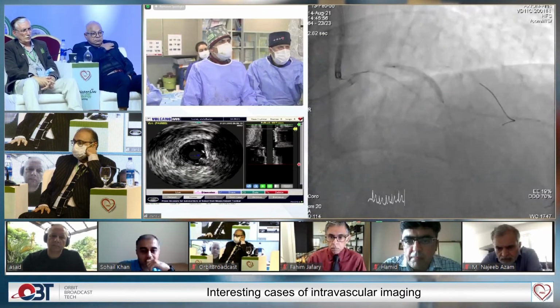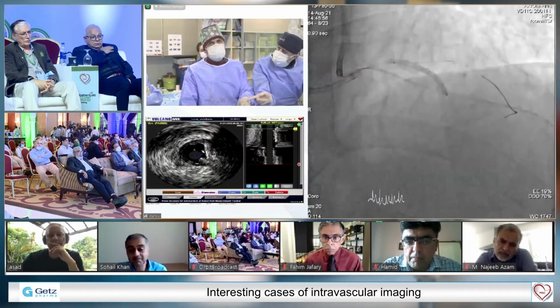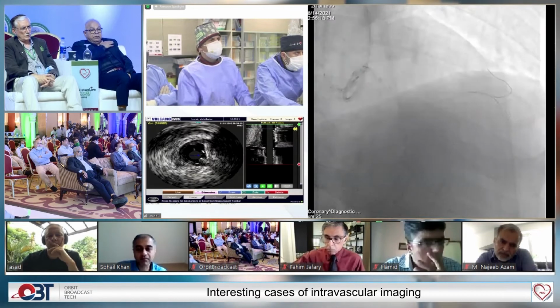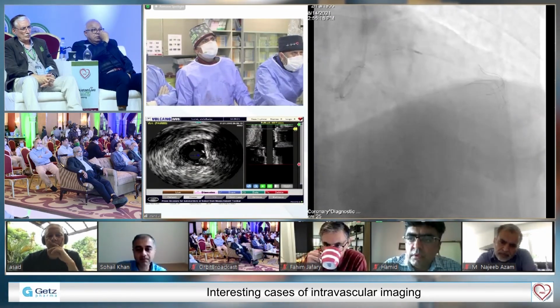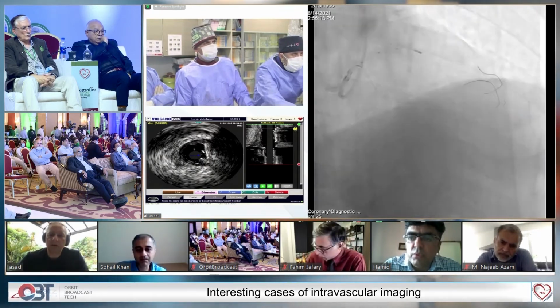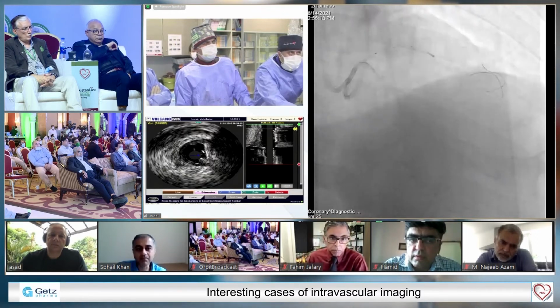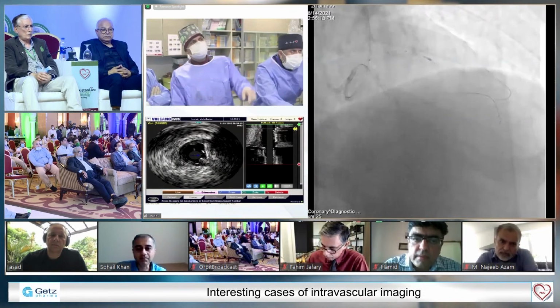I like to see IVUS, the two aims. The first, I like to see my wire course, if it is intima or subintima. Somehow I think it's subintima. But more importantly, I like to see the size of the distal LAD. So why didn't you do IVUS before doing the balloon inflations? I don't think it would cross easily, even if I did balloon dilatation. It's not easy.